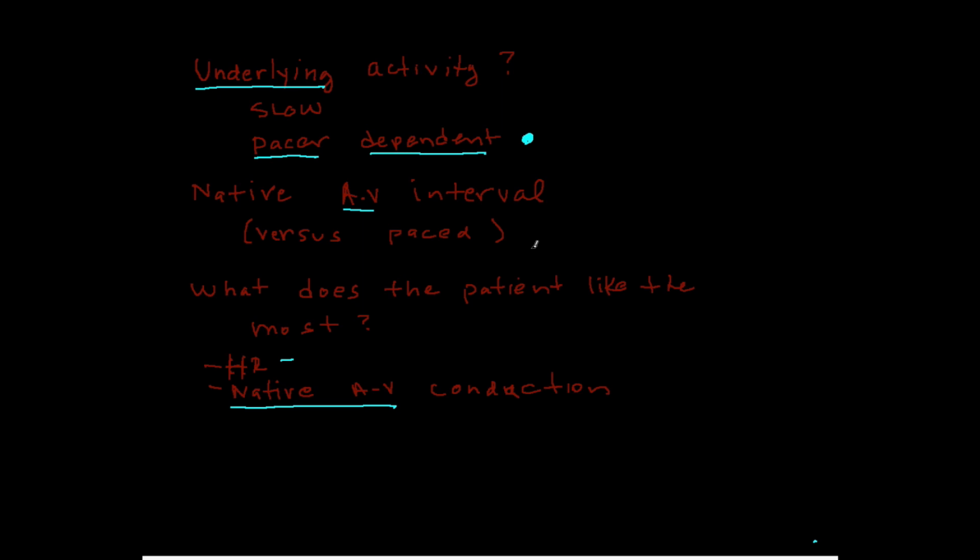Main thing is, if you're kind of a neophyte here, don't get too far along if this is the problem here. Identify that they're pacer dependent. Don't spend too much time in asystole. Get to the bottom of it. Make sure there's an awareness. Make sure you've got a backup plan, because that could be pretty dangerous.